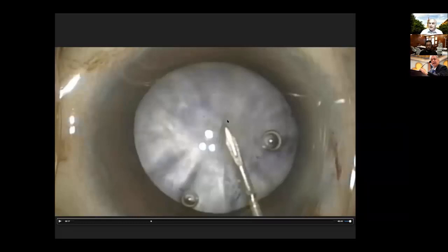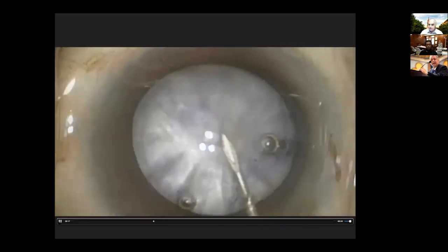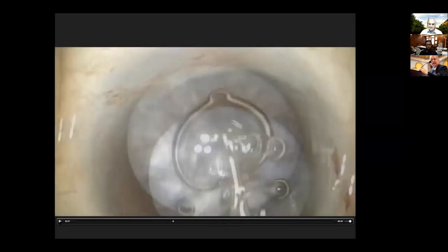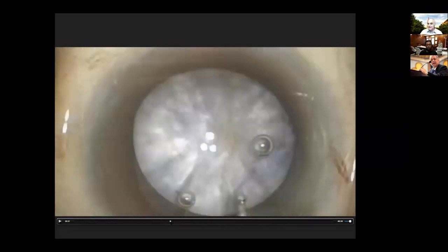And at the same time, once you go out to exchange, you inject viscoelastic and you decompress. This is the second thing. You decompress the bag. What is the difference between this and the normal case? The pressure is high. So first step, I made a curved incision so as not to be surpassed by the high pressure and extension to the equator. Second, I'm going to convert the different situation into a regular situation.